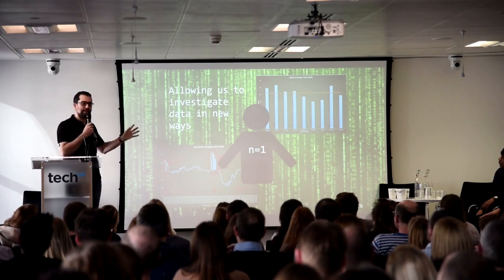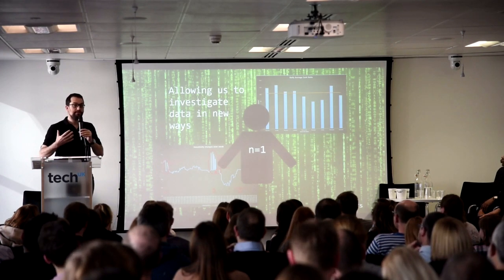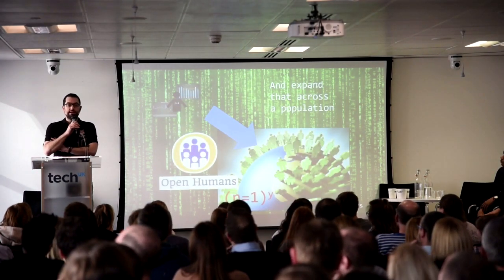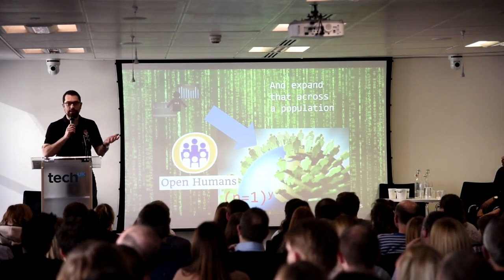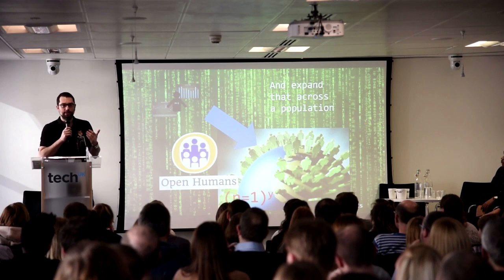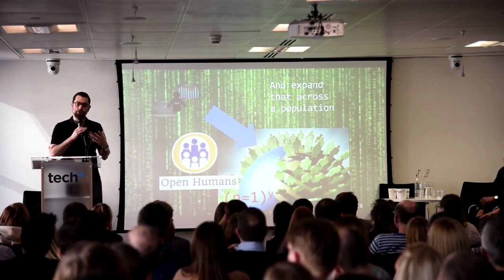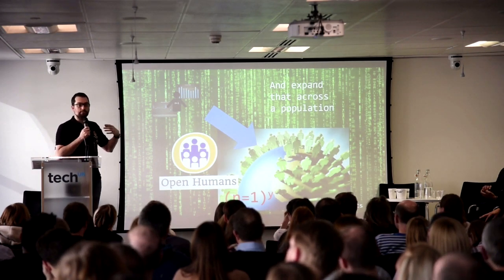So if you've got all of this data and you're capturing it, storing it, and we are able to derive it from the data that we've captured in Nightscout already, what can you do with it? Well, you can take it across everybody who's using something like this. So Dana mentioned 576 plus people looping. I think that's not as many as we have. I think there's well over 1,000 people based on what we see on the internet. And what has been set up is the openhumans.org community allows us to transfer all of this data anonymously into a place where anybody can access it and can then use it to do big data research.